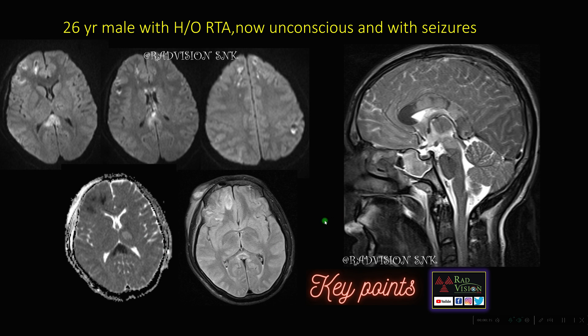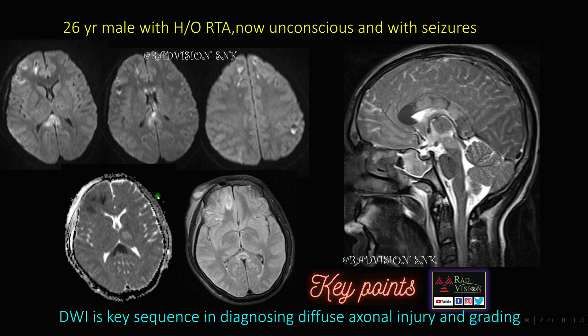If you are suspecting diffuse axonal injury, here also you can see there is typical edema noted in the body and splenium of corpus callosum which is showing restricted diffusion on DWI. Diffusion weighted imaging is a key sequence in diagnosing diffuse axonal injury and grading of DAI.